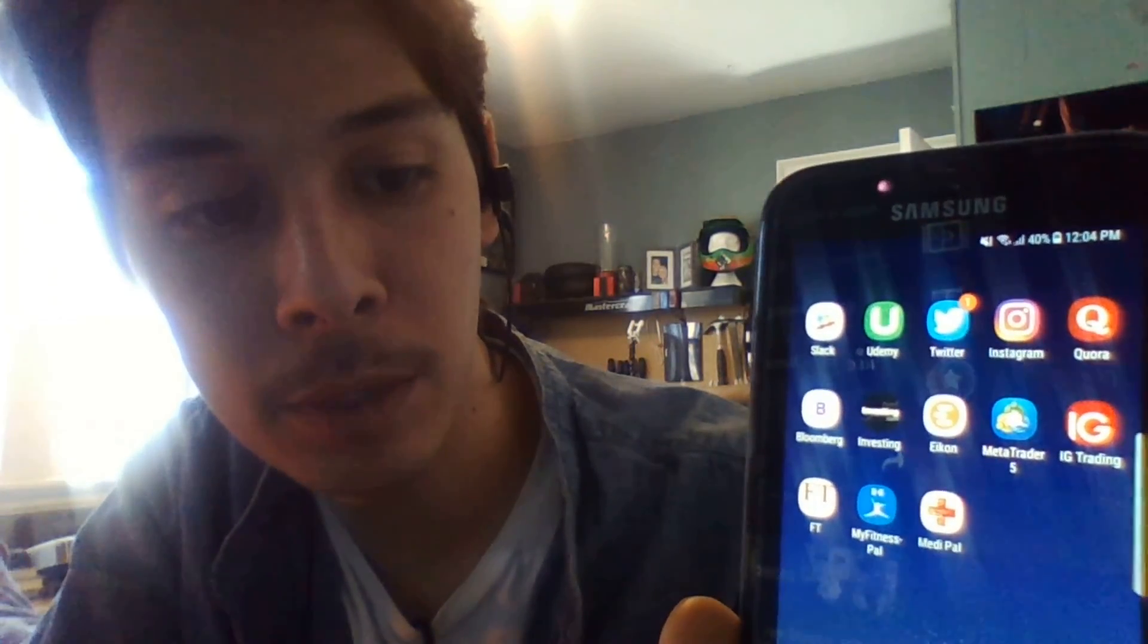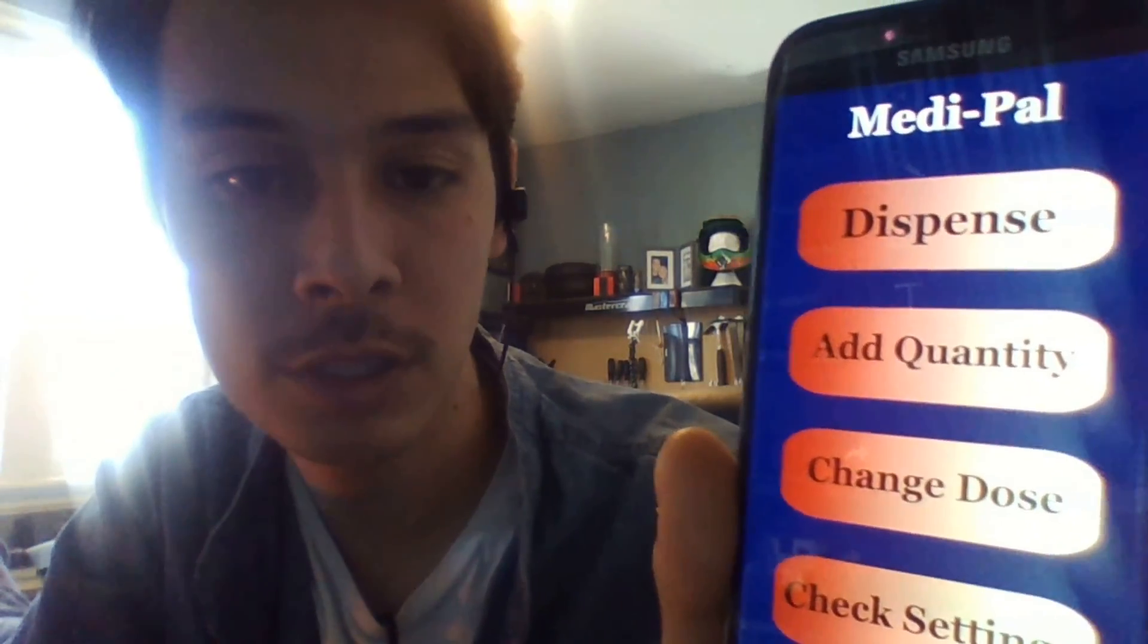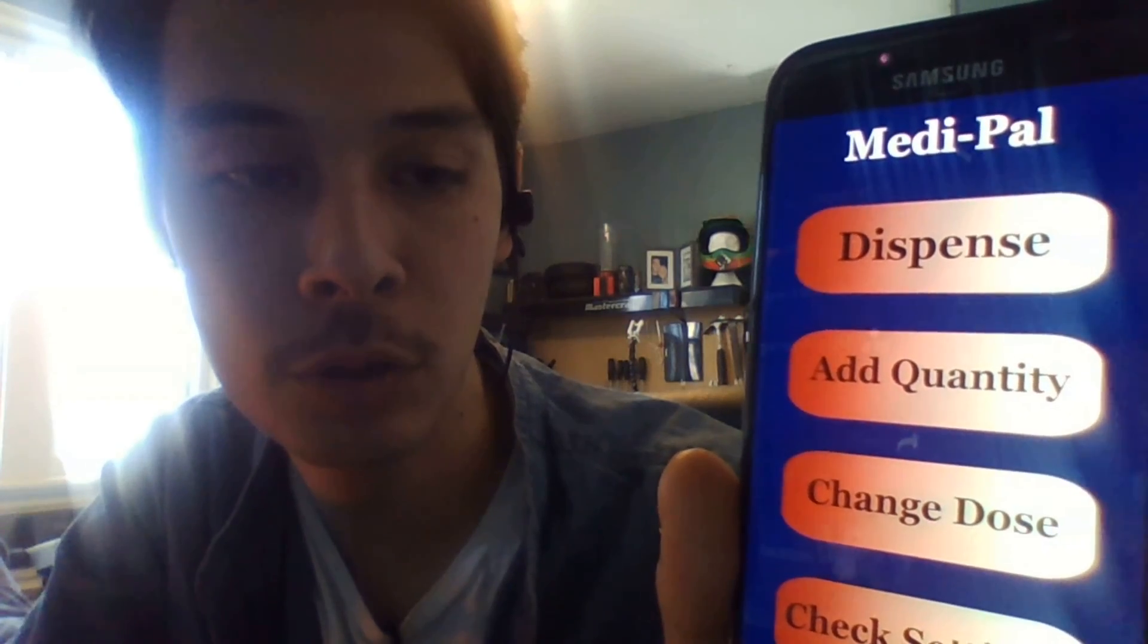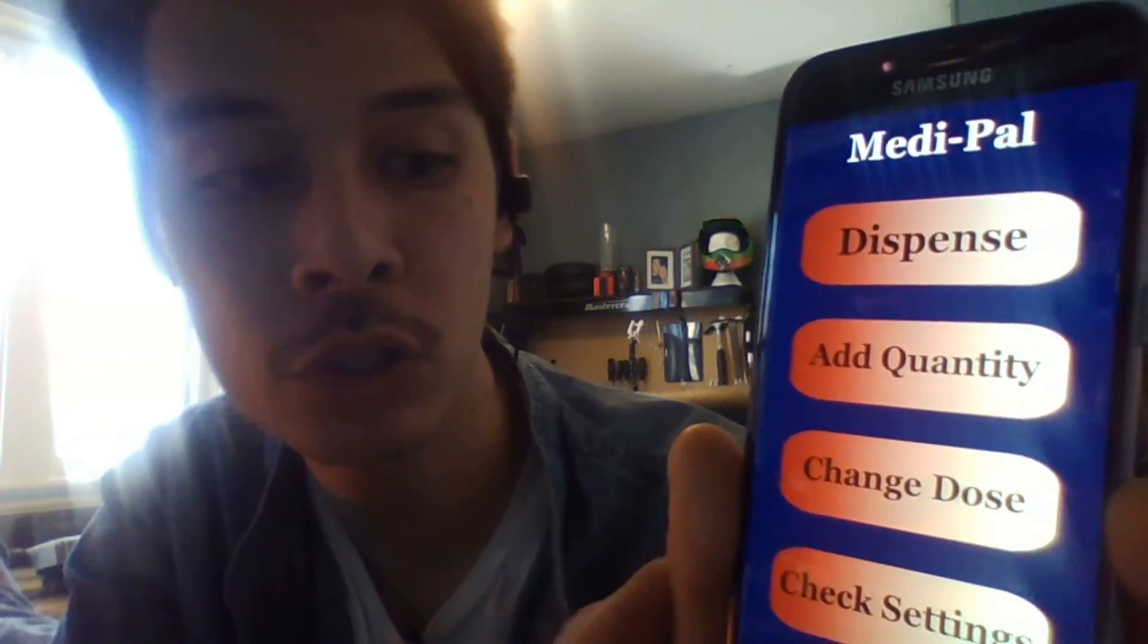Here's the mobile application. It's called MediPal. Once you open it up, you have your four main functions, same as the computer version: dispense, add, change, or check.